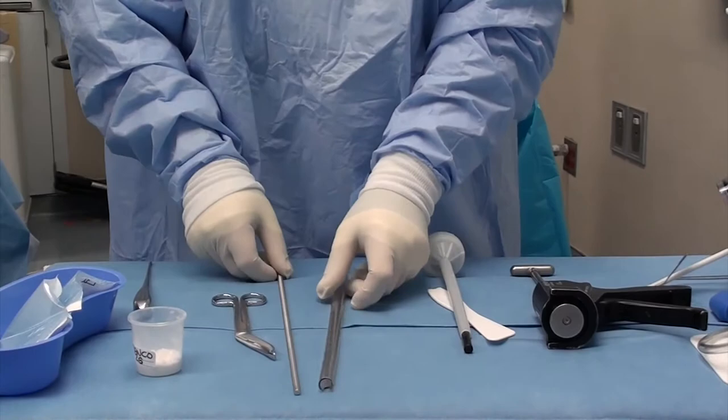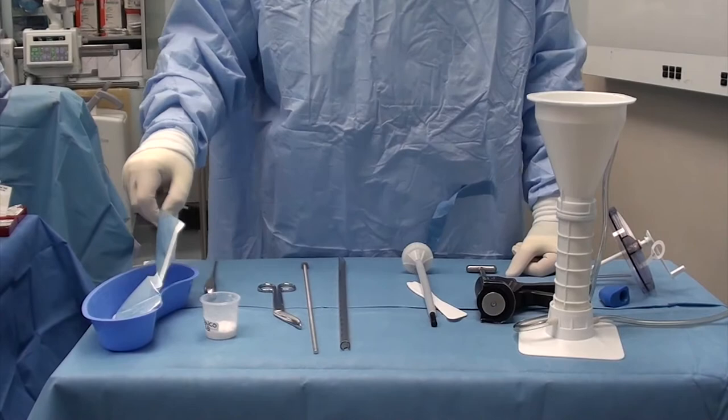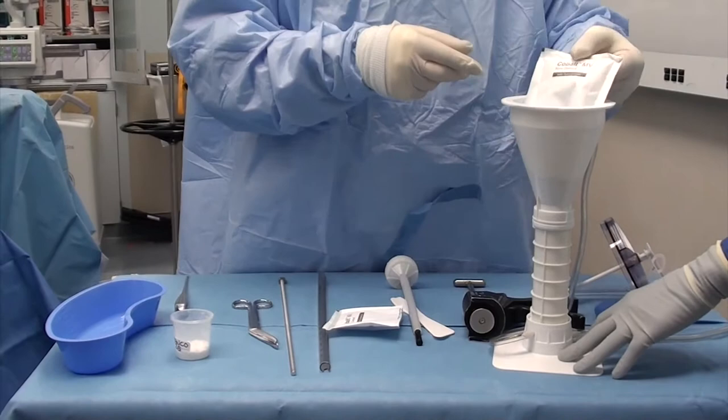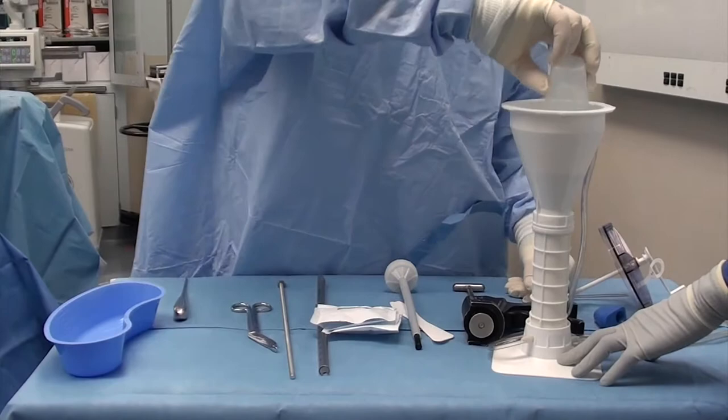Our next step is to go ahead and mix our cement with our antibiotics. Since we have a very long rod of 400 millimeters, I'm using two bags — two 40 gram bags of cement. I choose to use a medium viscosity that's already loaded with some gentamicin, and I'm going to add vancomycin to the whole mixture.